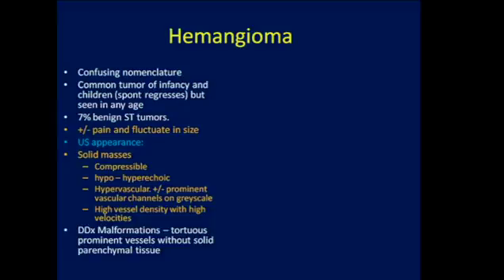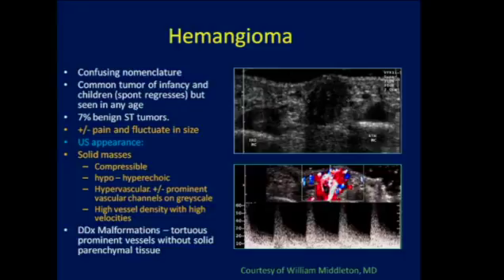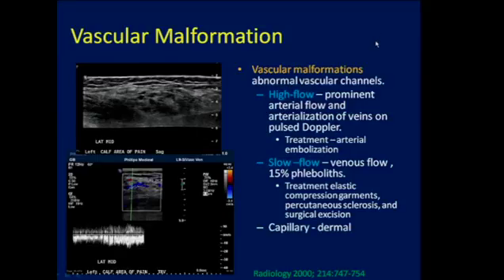They are benign soft tissue tumors. They may or may not present with pain, and their size may fluctuate. On ultrasound, they're typically compressible. They may be hypo or hyperechoic, and one sees hypervascularity. Let's look at this case, courtesy of Dr. Middleton. We have a focal hypoechoic mass that on color Doppler imaging has incredibly high vessel density with high velocities on pulse Doppler imaging.